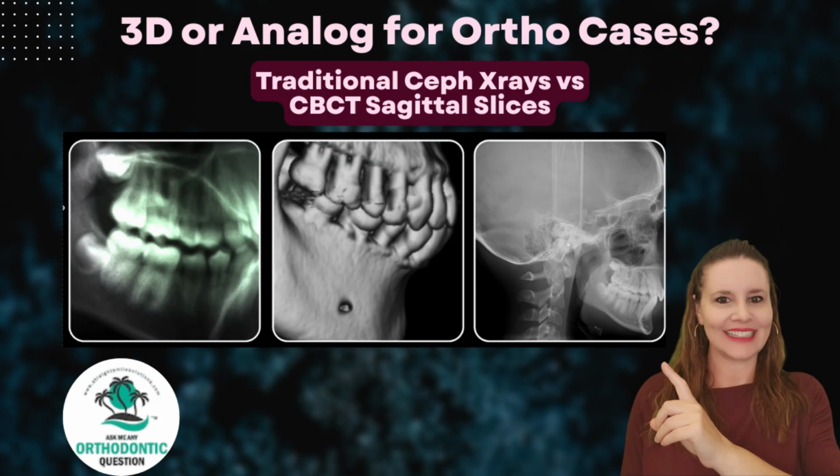And remember, Invisalign is not going to do your treatment planning for you. Just because you gave them a CBCT doesn't mean that it's going to make your Clincheck any better. It's for you to be able to visualize the Clincheck so that you can tell them what to do. And that's the part I want to clarify with you. They don't do anything different.